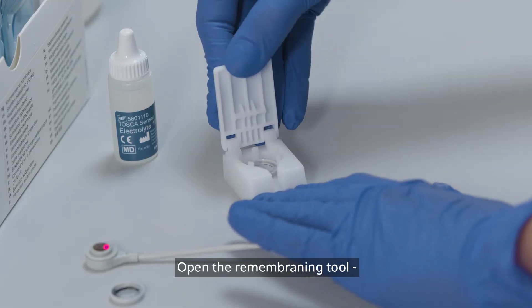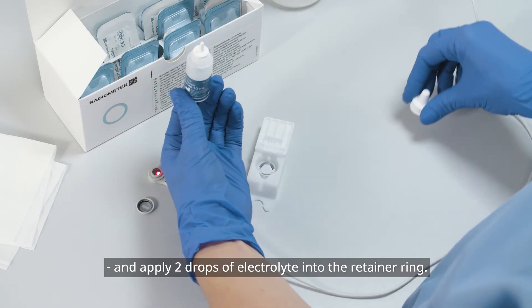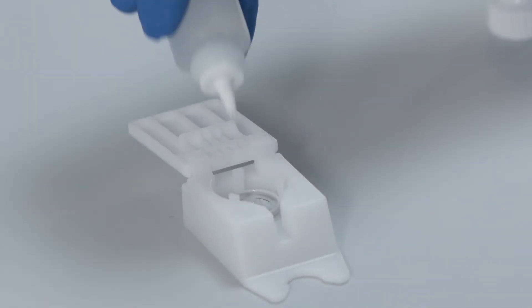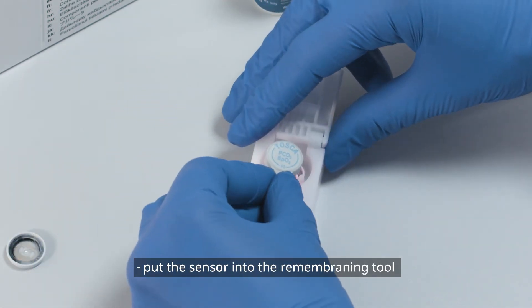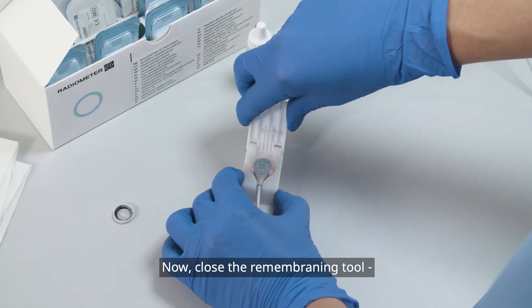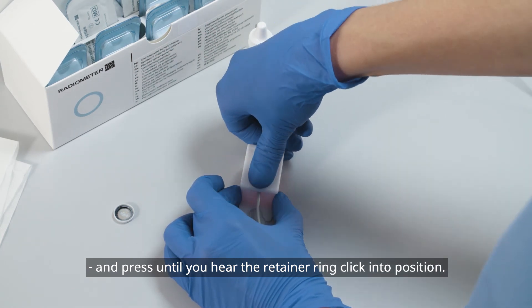Open the re-membraning tool and apply two drops of electrolyte into the retainer ring. With the surface pointing downwards, put the sensor into the re-membraning tool and press gently until it is locked. Close the re-membraning tool and press until you hear the retainer ring click into position.